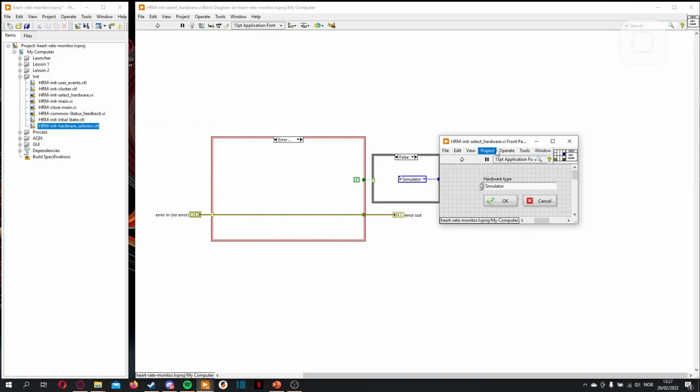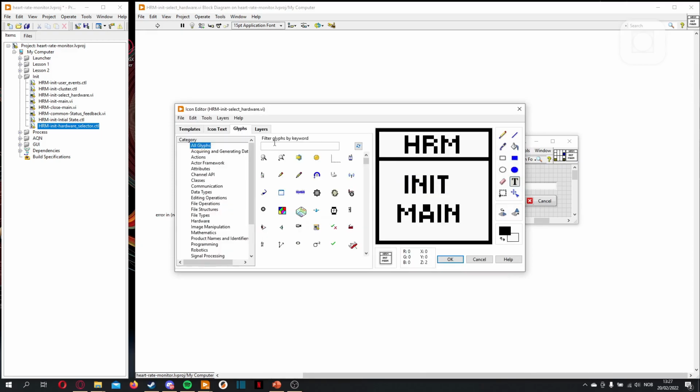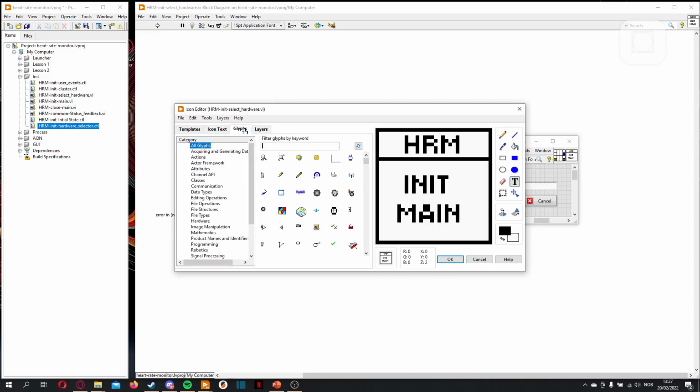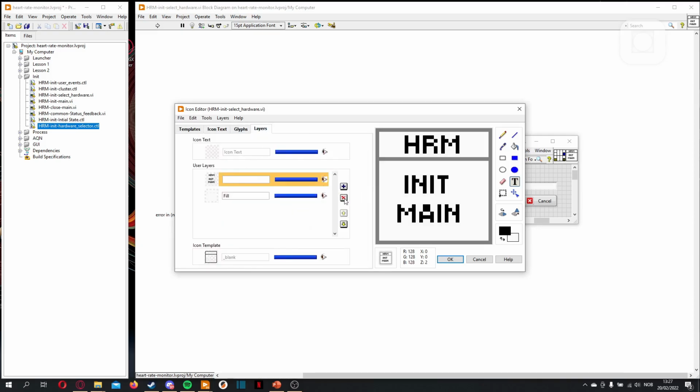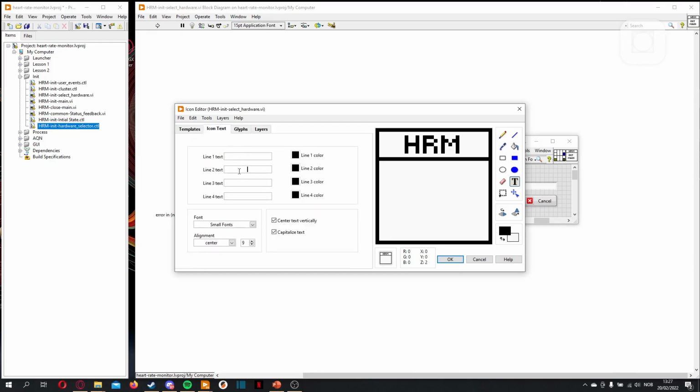Now we need to place, or first we should change the icon. I guess it's here. No. Yeah. So here you go. Heart rate monitor. And then we can actually use this one instead. Select hardware.